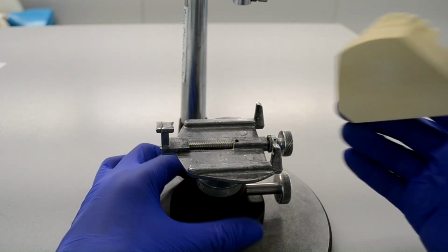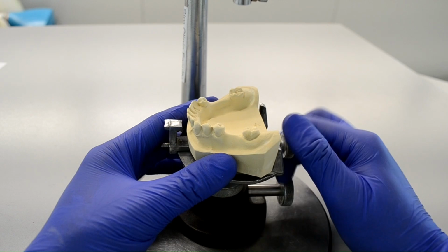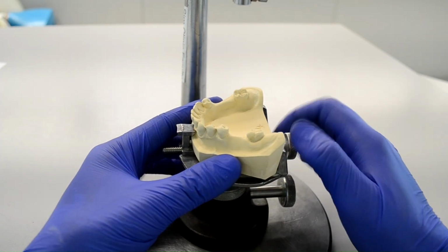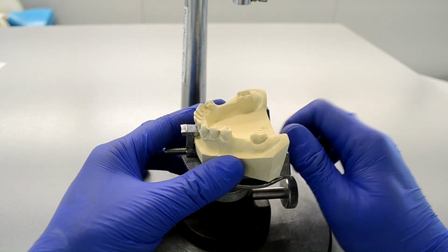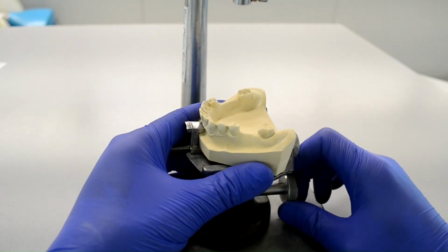We will start by securing the cast onto the table. We want to make sure that the screw is tight enough so the cast is not moving, but not too tight as to break the cast. You also want to make sure that the occlusal plane of the cast is fairly level with the horizon.